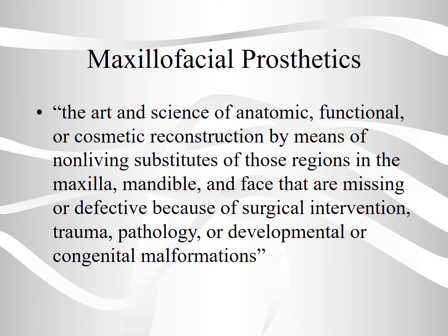Maxillofacial prosthetics is the art and science of anatomic, functional, or cosmetic reconstruction by means of nonliving substitutes of those regions in the maxilla, mandible, and face that are missing or defective because of surgical intervention, trauma, pathology, or developmental or congenital malformations.